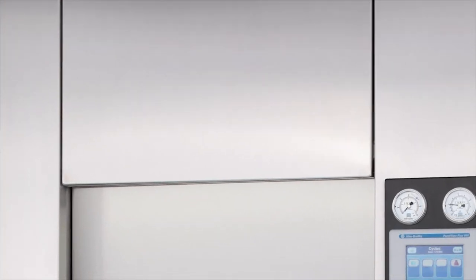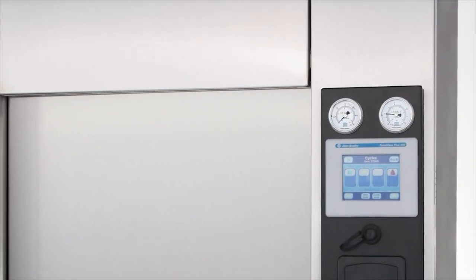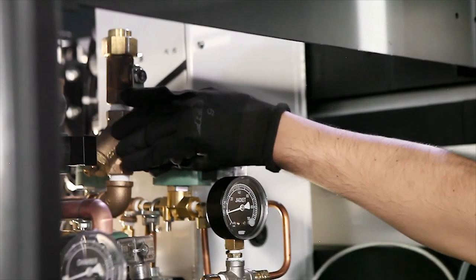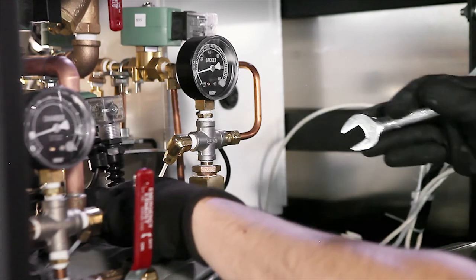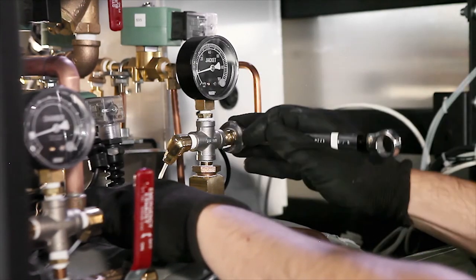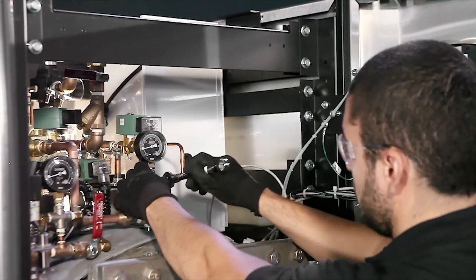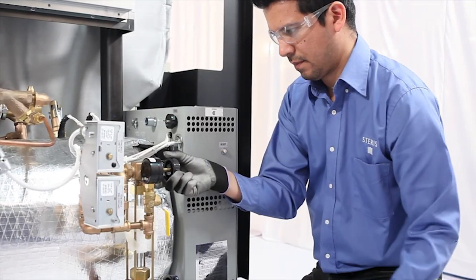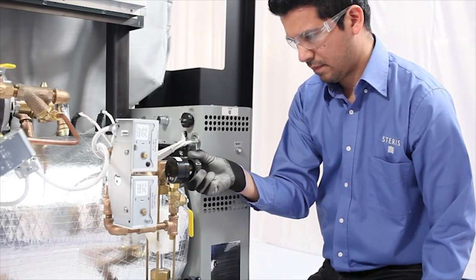Take advantage of our global service specialist team for scheduled preventative maintenance along with any unscheduled needs. With access to a broad inventory of OEM parts and 24/7 technical support, Steris is dedicated to delivering exceptional service to maximize uptime use of your equipment.